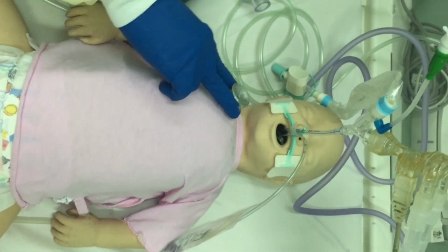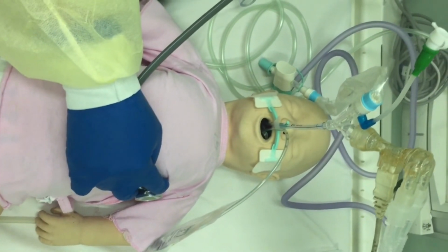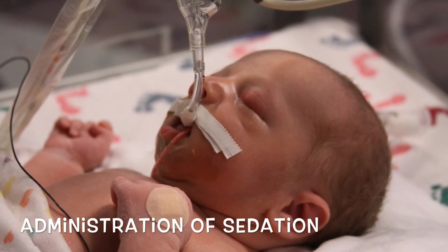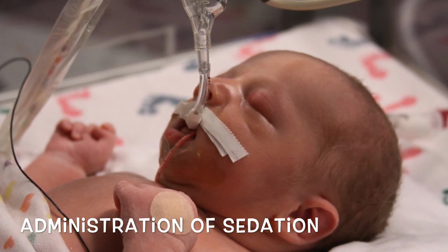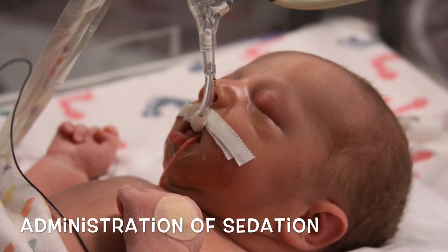Auscultate breath sounds and interpret the findings. Sedation should be given for patients on high frequency and assist control mode to relax the baby and avoid fighting against the ventilator.